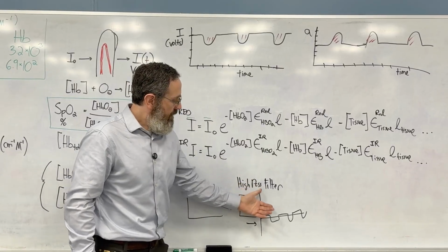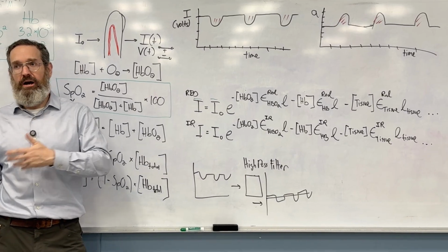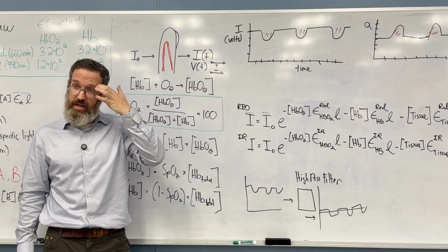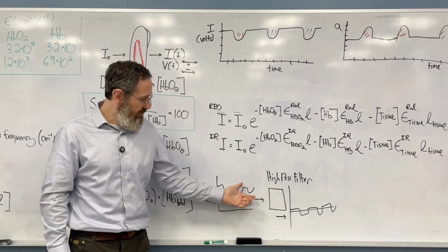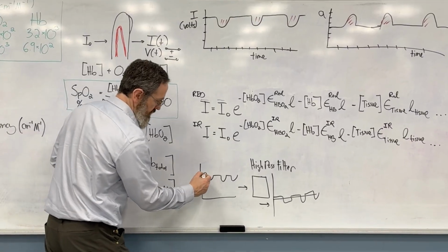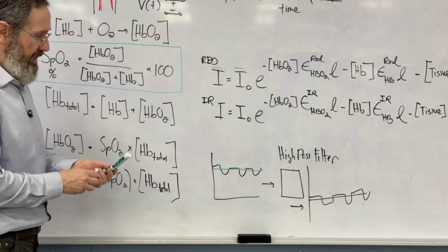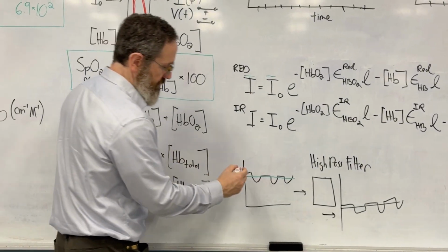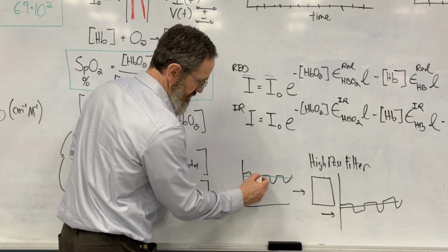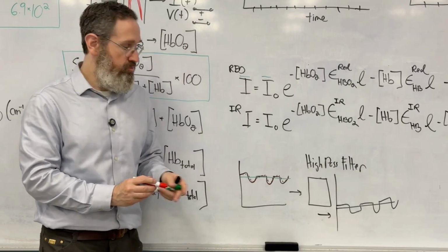I talked about how we design filters without math, right? There was a previous lecture, and I did that on purpose. I said, when you have a signal, and there's something slow in the signal, let me draw the slow part in green, and there's something that's changing, which is what's in the red. So one is really, really slow.